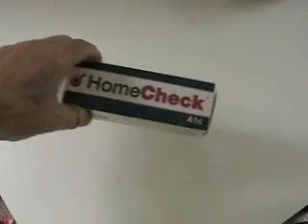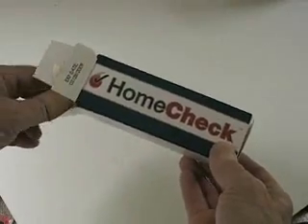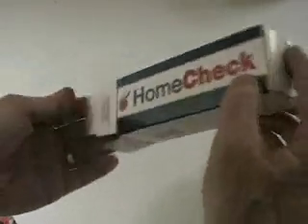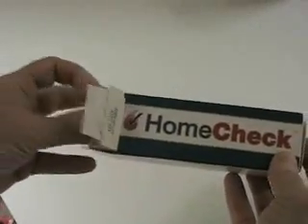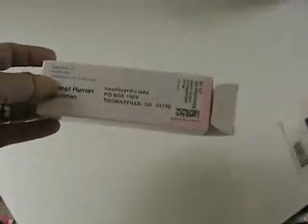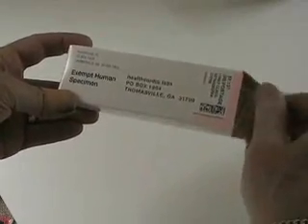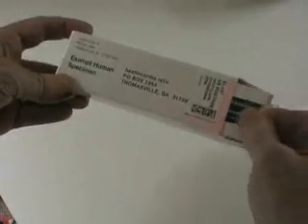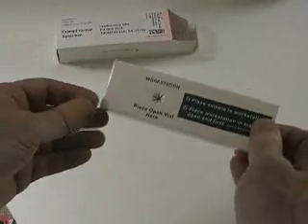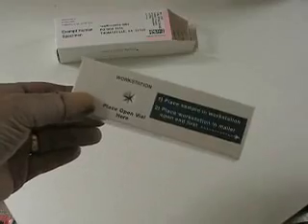The kit itself arrives in a fairly neat rectangular box. When you open the end of it, what you get inside is a pre-stamped mailer to return the sample in. It's a bit like a Russian doll — when you open that, you get what they call a workstation. The workstation is what you use to actually hold the sample while you're taking it from your blood.